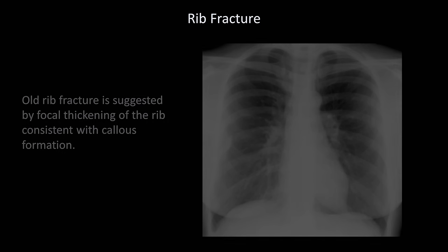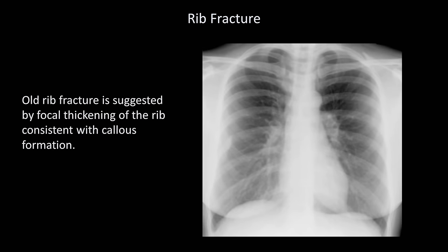Both of those fractures were relatively acute. However, sometimes old fractures can be identified as well. This is suggested by focal thickening of the rib consistent with callus formation. This patient has a probable old rib fracture of a right posterior rib. Be careful, though, because these can be mistaken for sclerotic bone lesions, and vice versa.